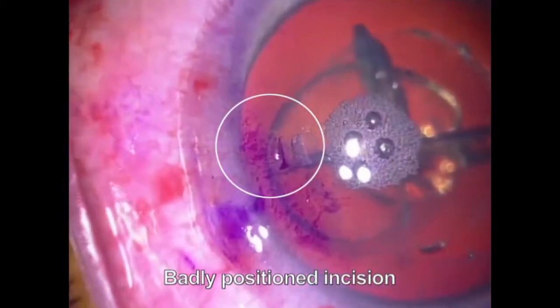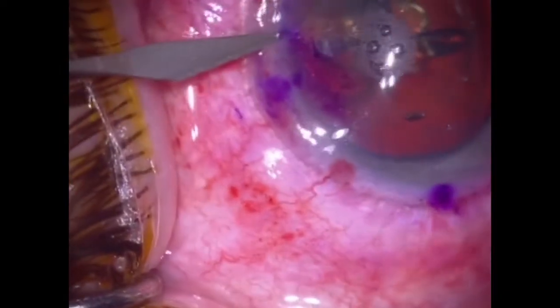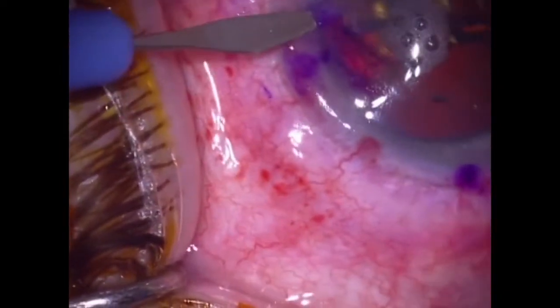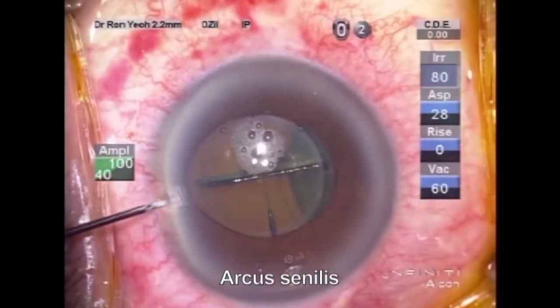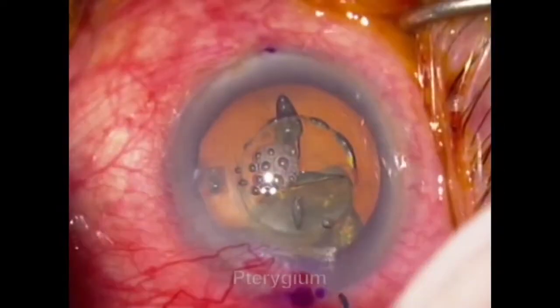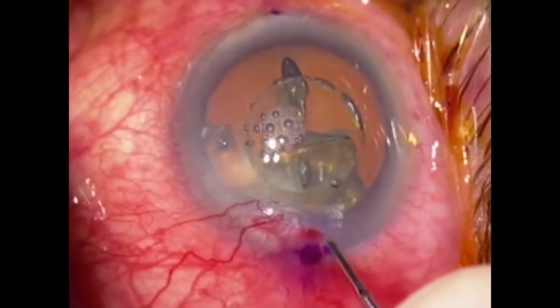Femto incisions are occasionally placed too centrally and should not be used. New keratome incisions should be made. Placing a femto incision over an area of arcus senilis or a pterygium also results in imperforate femto incisions.